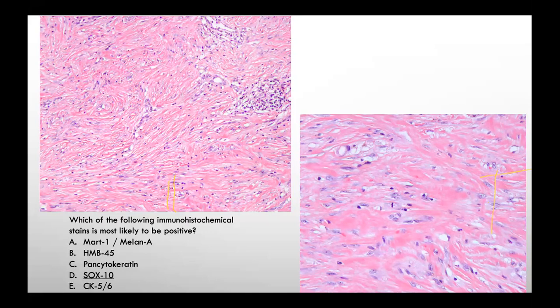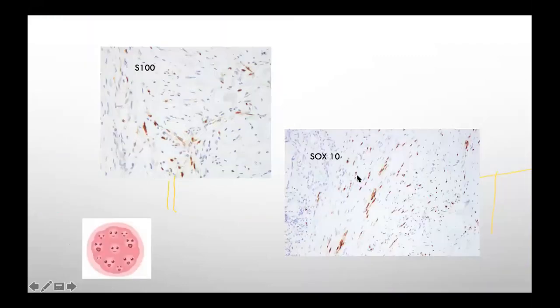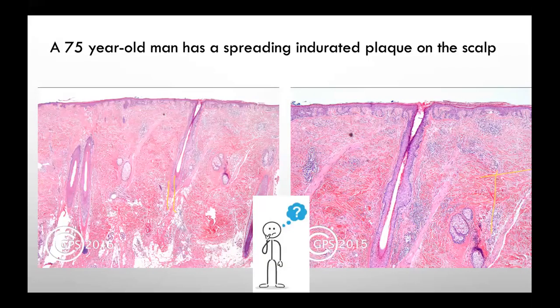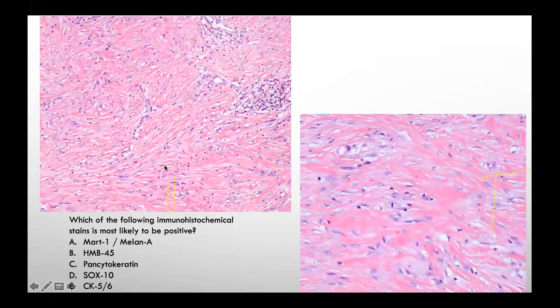Desmoplastic. Exactly. Yes. It is a little bit of a revision of what Dr. Amin said. As you see here at scanning, the reticular dermis is altered by the cellular infiltrate, including nodules of clusters of lymphocytes. You can appreciate here the clusters of lymphocytes, which can simulate an inflammatory process, but the dermo-epidermal junction will give you a hint as well that it is a desmoplastic melanoma. At higher power, you will see the atypical spindle cells going deep into the dermis and subcutis, separated by thick, dense collagen bundles with a background of solar elastosis and scarring as well.